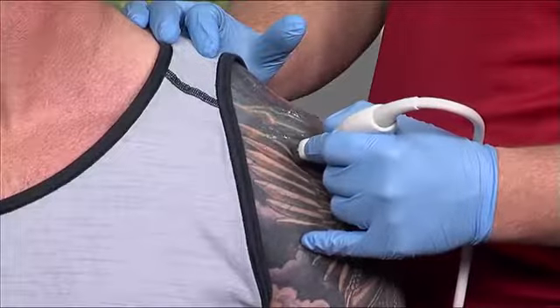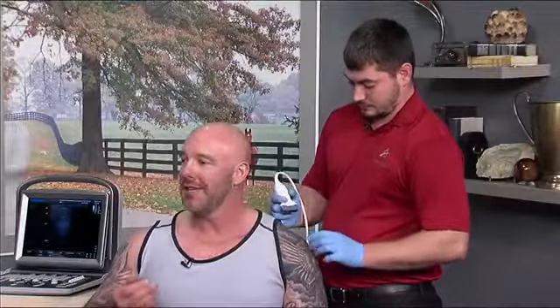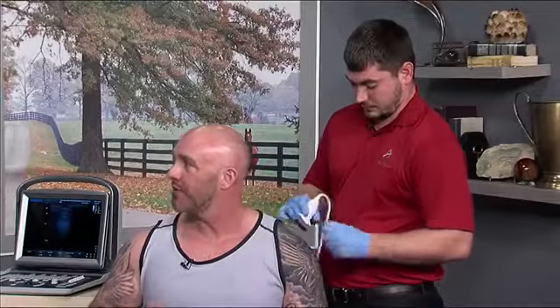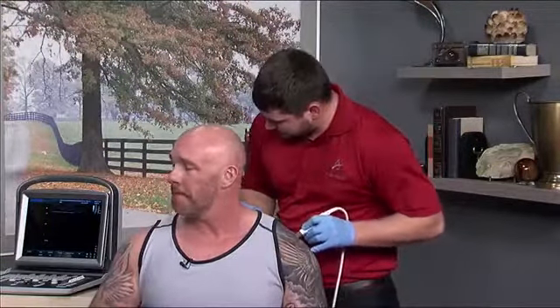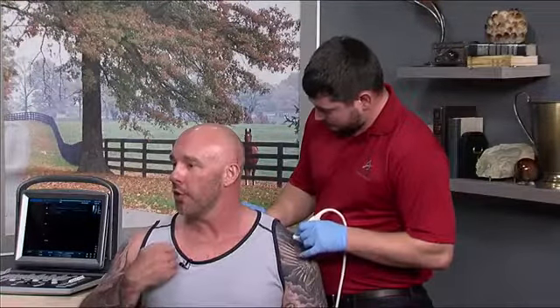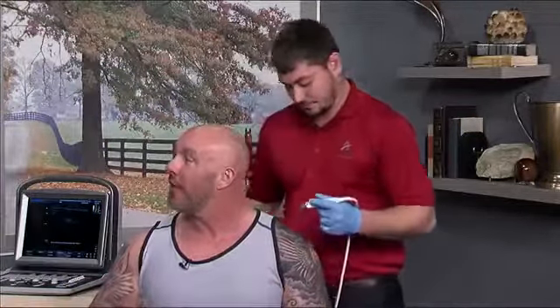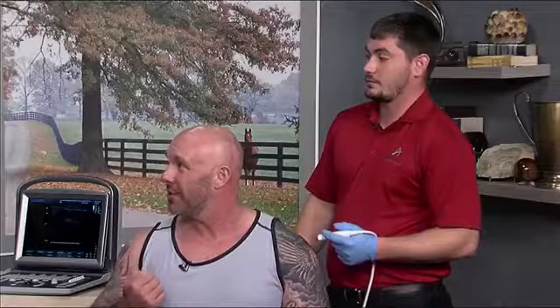But I want to ask you, what am I looking for? Ultimately, when we're diagnosing or we have a referral or somebody comes into our clinic, we are assessing for tears in the tendons or tears in the muscles or tendonitis or bursitis, inflammatory issues going on inside the tissue. And our ability to determine those from our normal physical therapy testing is not that great according to the research. So this allows us to see underneath the skin, which we can't see with the human eye, and we can't really test it that well with our testing abilities.